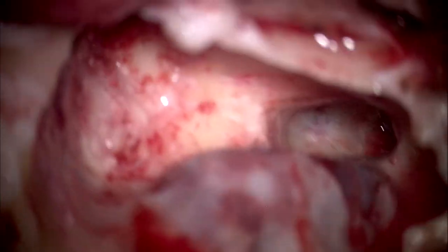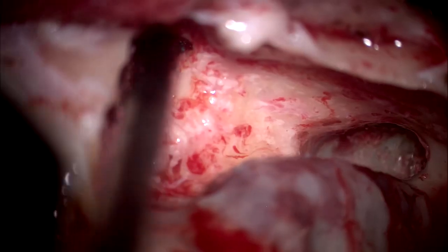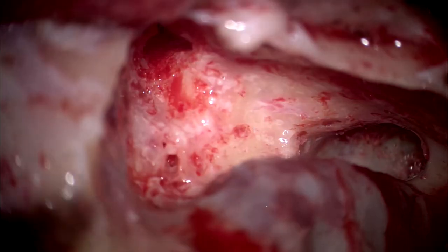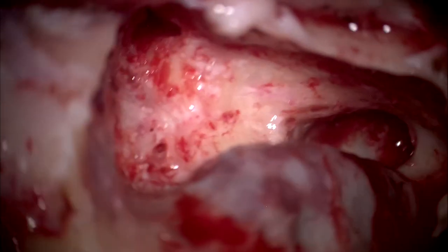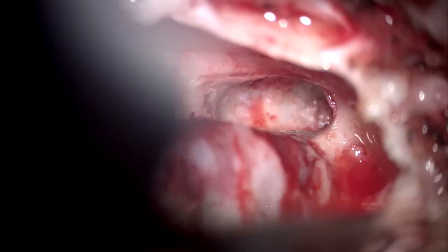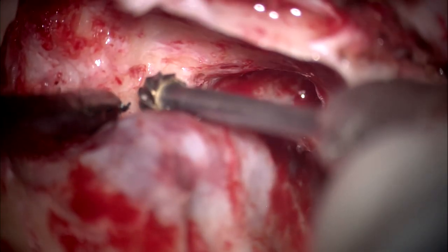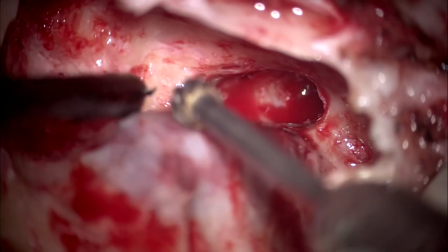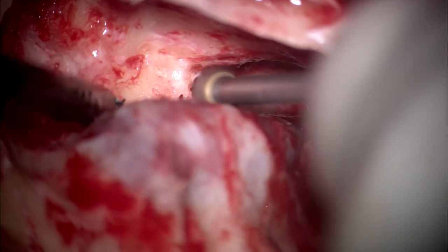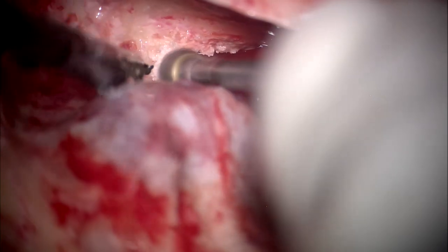Cutting is next, sir. We have already defined the facial nerve. We have to define all three canals so that we can drill out the labyrinth completely. Our space for the tumor removal would be between the facial nerve and the jugular. See how narrow the space is? It will be increased by decompressing the sinus later, okay? I don't want to remove this bone right now. It will help protect the jugular bulb from injury during drilling.